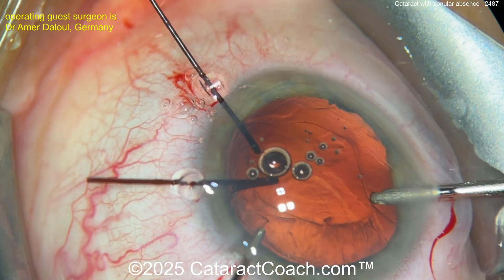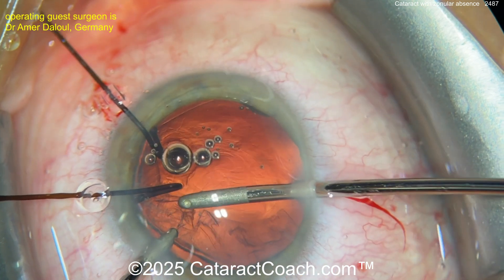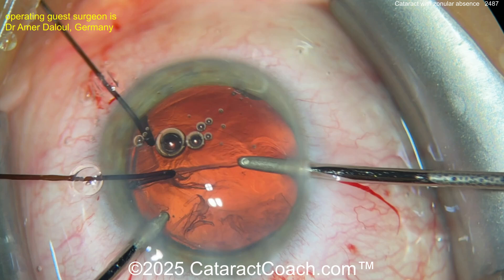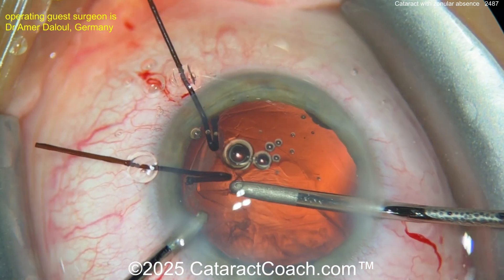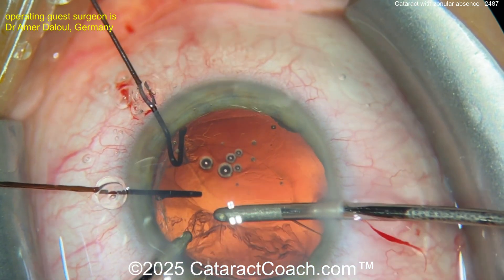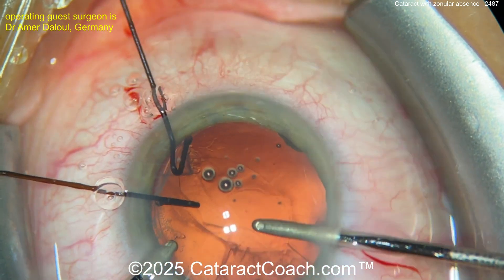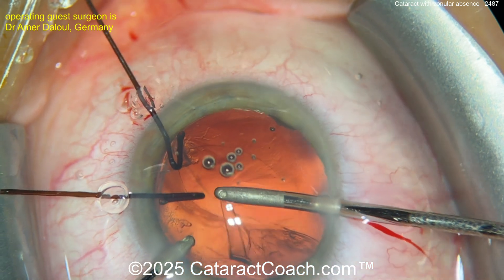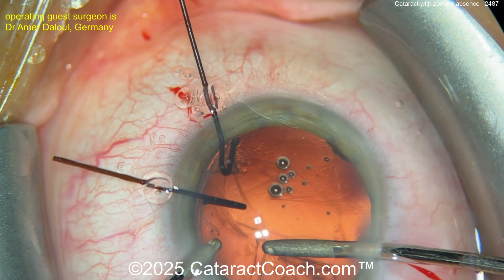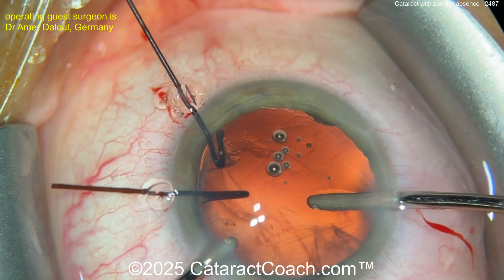Very nice — switching hands. Now watch carefully: what's the shape of the rhexis? Remember the rhexis started off completely round — the capsulotomy, if you will, completely round — but because of so much zonulopathy it's going to be more oval shaped. You may want to put in another capsule retractor and use the IA probe to help hold the edge of the capsule back. You can use the infusion cannula line to hold the capsule while the aspirating one grabs the cortex — otherwise without counter-traction it's a lot more challenging.